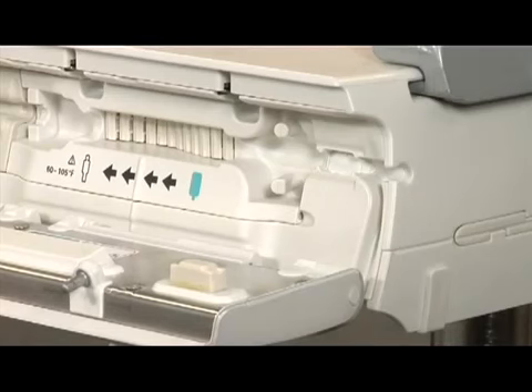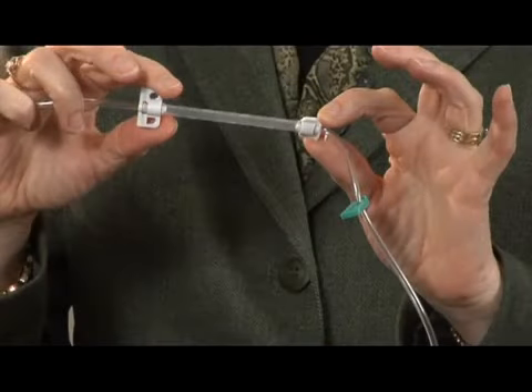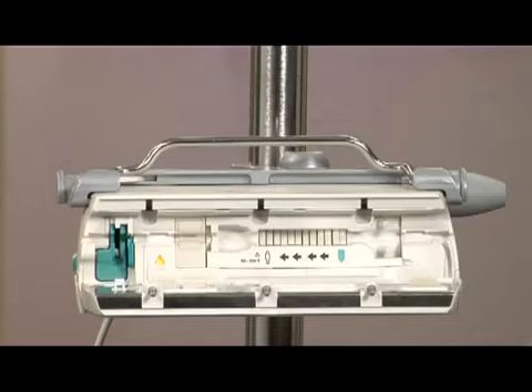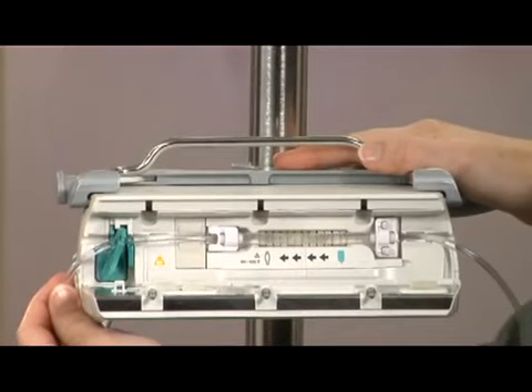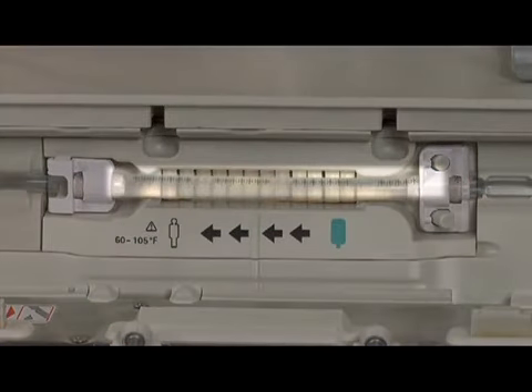The IV set must be loaded from right to left. Locate the silicone segment. Hold the two-hole clip in your right hand and the white pronged clip in your left hand. The two-hole clip should be aligned so that the O is at the top and a backwards D is at the bottom. Place the two-hole clip on the two pins on the right side of the pump. Insert the white pronged clip without twisting the IV set. Be sure not to stretch or twist the silicone segment. The printed stars on the silicone segment should be in a straight horizontal line once the two clips are in place.